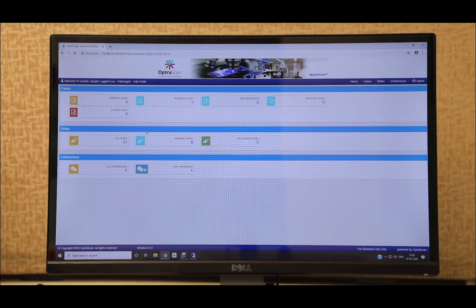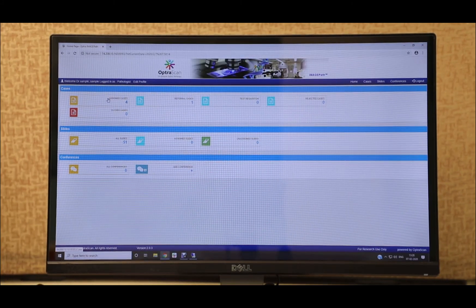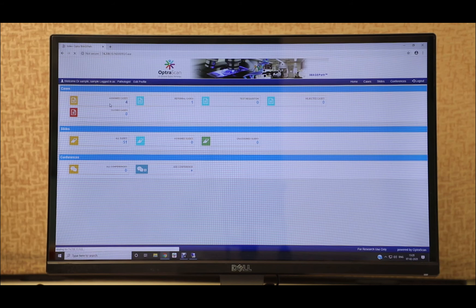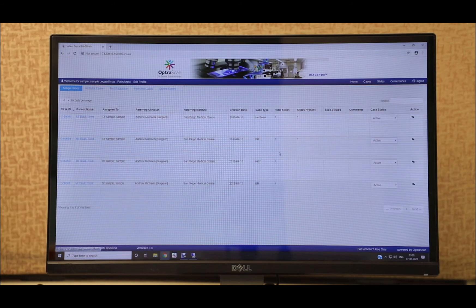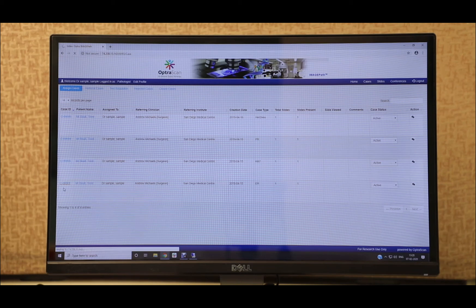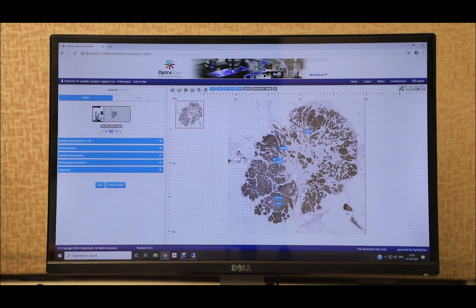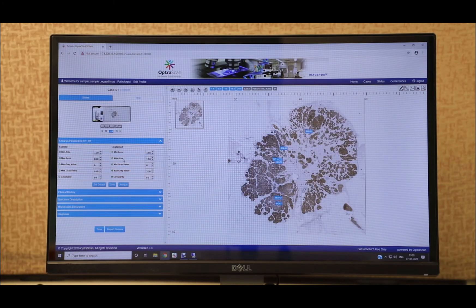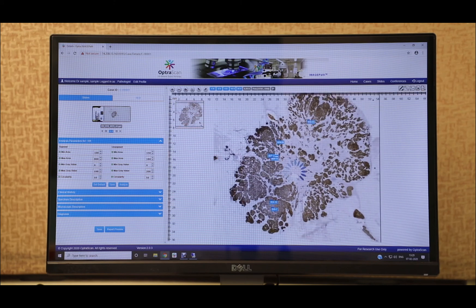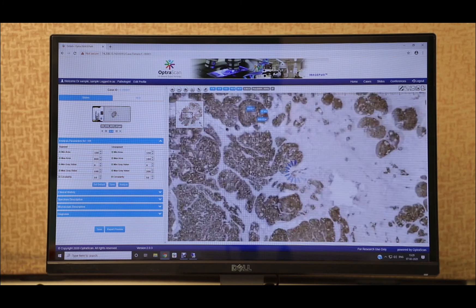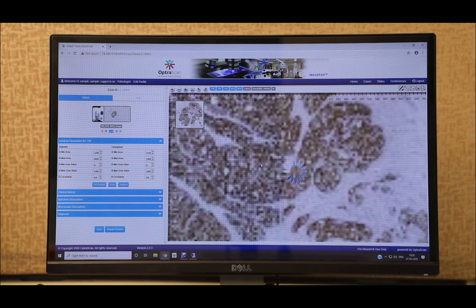Finally, we have OptraAssays, our image analysis software integrated with ImagePath. OptraAssays is an AI and ML-based application that allows for multiple image analysis features on multiple stains, including but not limited to cell quantification, differentiation, and morphometry.